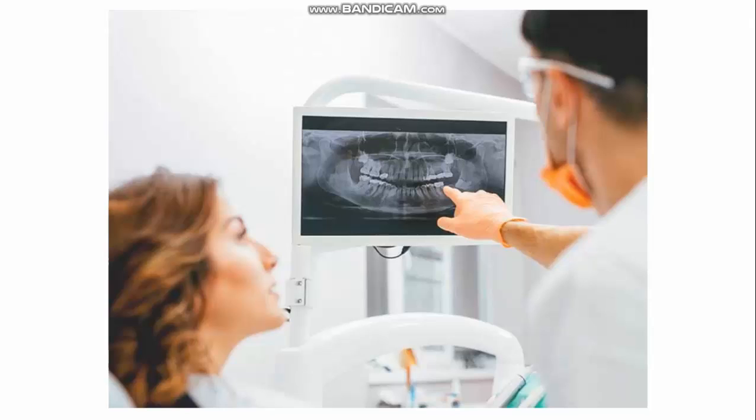As you know, in dental radiology we can use different types of radiographic imaging and modern diagnostic imaging such as computer tomography, magnetic resonance tomography, especially cone beam computer tomography.